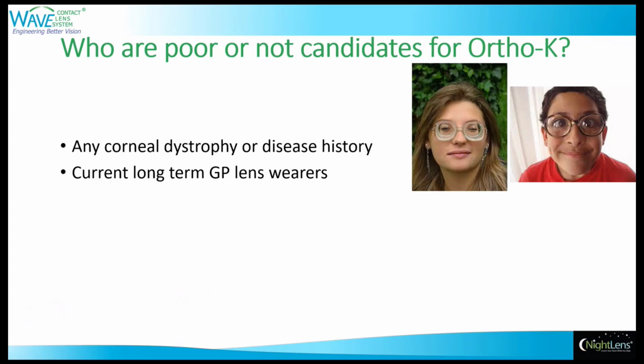The reason these are not candidates is because we have no idea what their pre-fitting corneal curvatures were.